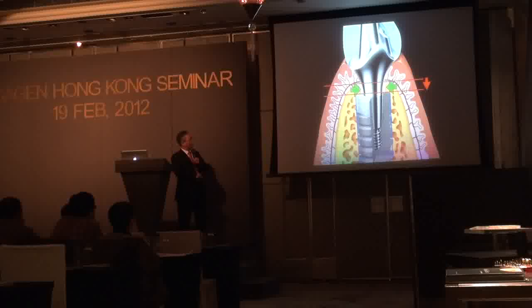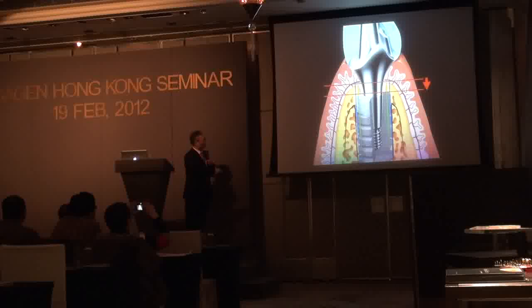And why don't we utilize this area of bone? I want to use this one. This is also very valuable bone. Why don't we use this area? And I try to make a smaller osteotomy socket than this one to place the same diameter of implant. Smaller hole, but it's unnecessary.